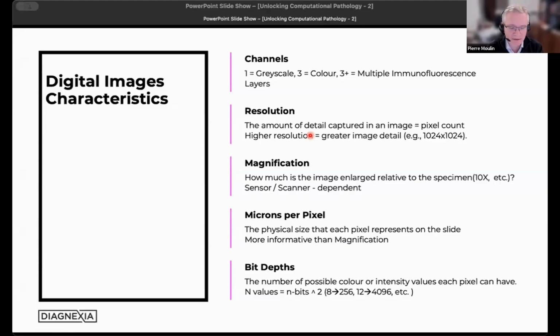If we consider a color image, for each pixel, there are 3 values. They represent the red, the green, and the blue, as we also perceive it physiologically with our eyes. And then there is this idea that we can stack as many channels, as many layers, as we want. For instance, to combine multiple grayscale images coming from different conditions of acquisition of a multiplex immunofluorescence image.